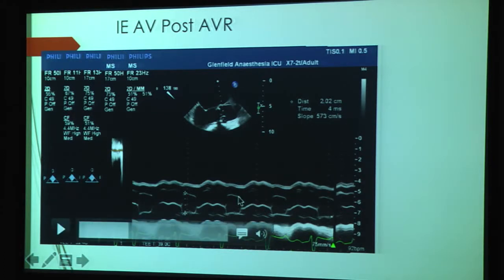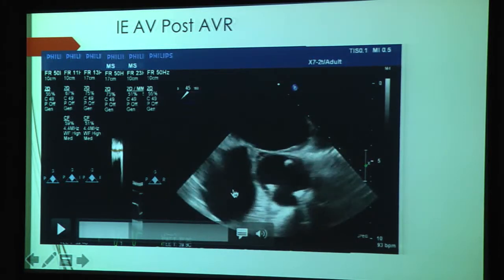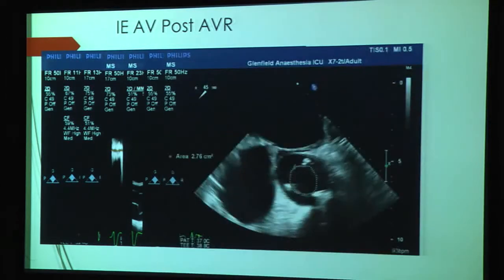As Kieran already said, you can put an M-mode Doppler through the leaflets of the bioprosthetic valve as well, and you can measure the separation. There should be more than 15 millimeters in an adult prosthesis, and it's 2 centimeters in this case. And I have a short axis view. You see the 3 support struts and the valve opening very nicely. You can do a planimetry. It's probably not the most accurate way, but it's possible.